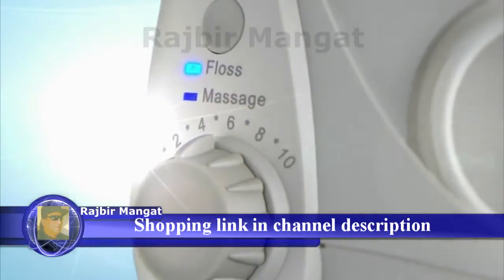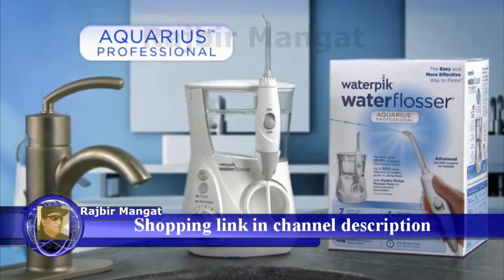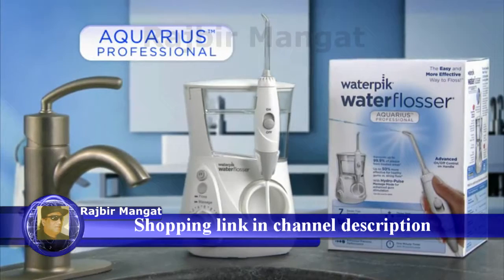Introducing the dawning of a new age in oral care, the Waterpik Aquarius, the most advanced and effective water flosser ever created.